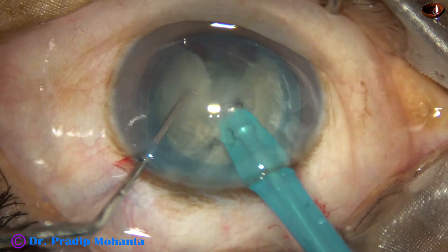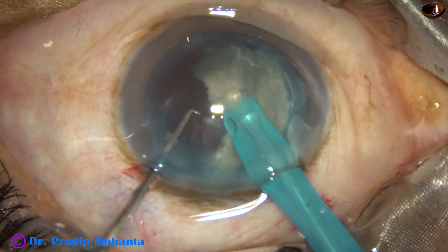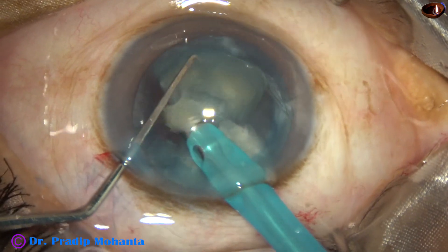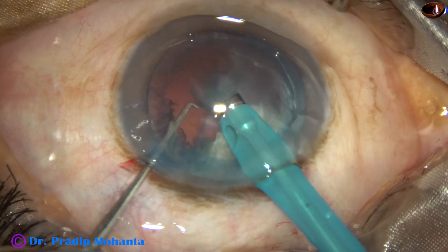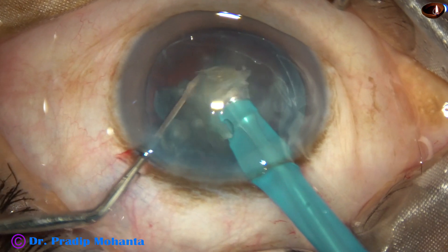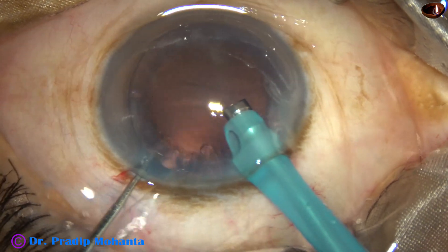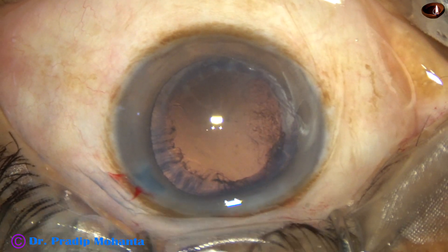Each fragment is now emulsified with ultrasonic energy, which is in this case about 50%. Flow rate is 45 ml per minute and vacuum is 400 mmHg. This is Faros from Oertli, Switzerland. This is the last nuclear fragment — we have to be very cautious at this time. If the anterior chamber is not stable, if there is post-occlusion surge, it is better to use a posterior capsule protector during emulsification of the last nuclear fragment.